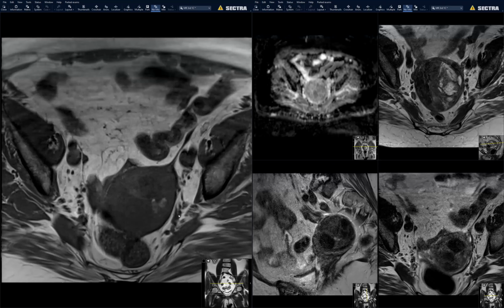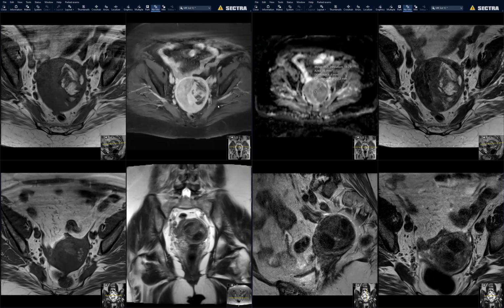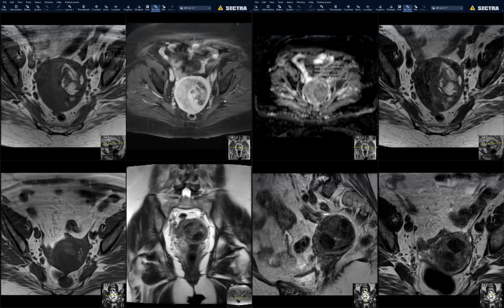Got it. I do have a comment about when you said a couple of times now it got bigger. That is actually not a feature that we should use to bring up leiomyosarcoma, because fibroids grow just as much and actually more than leiomyosarcomas. It used to be that if it's an enlarging lesion, then we'd be concerned about it, but then you would really be overcalling it because fibroids grow.